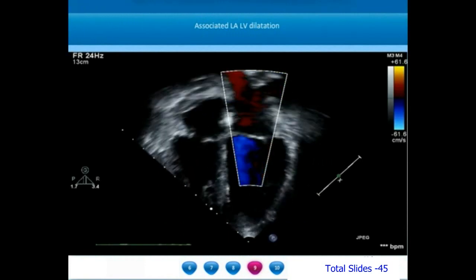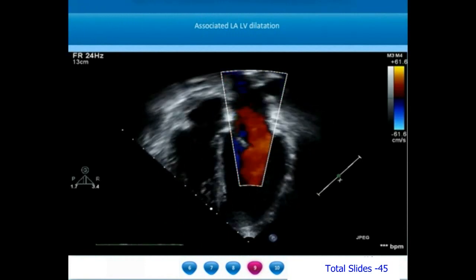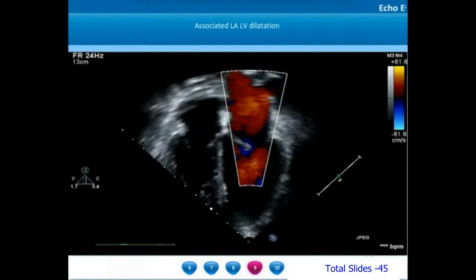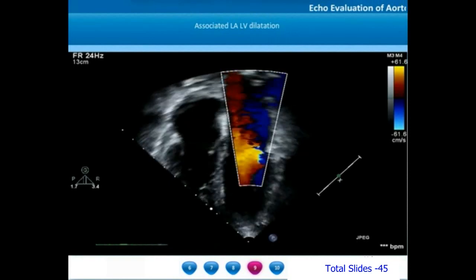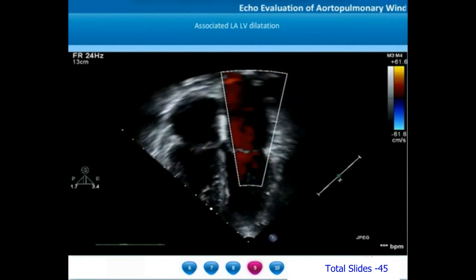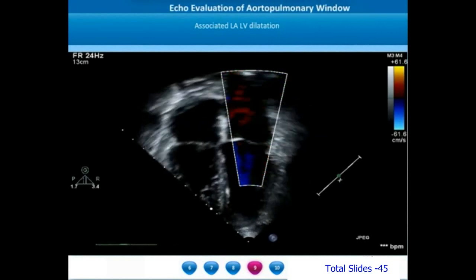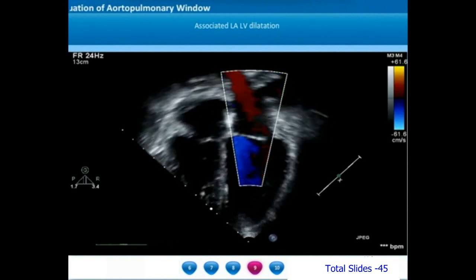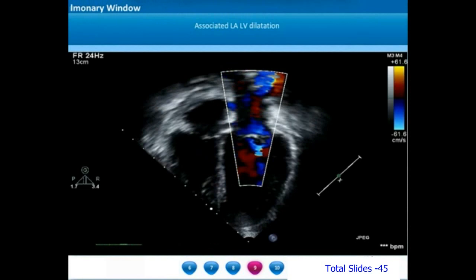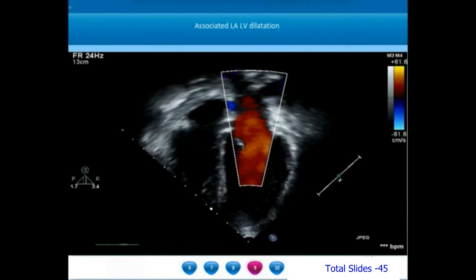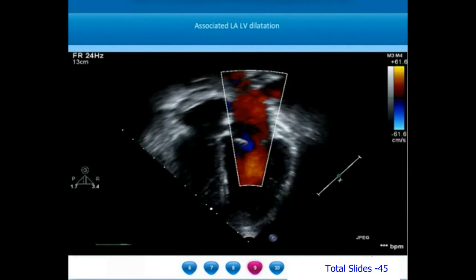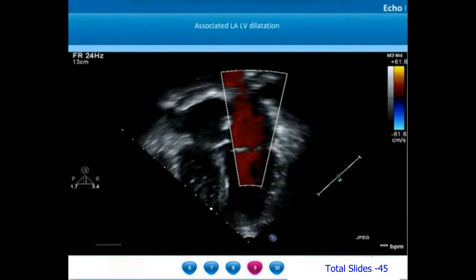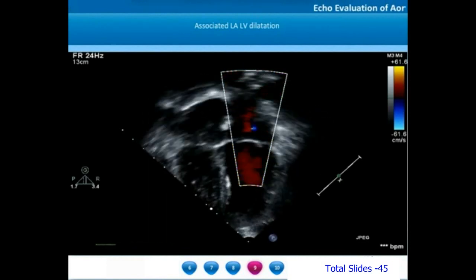Another way of identifying the presence of a large aortopulmonary window will be to look for an AP window whenever there is LA and LV dilatation. If there is a left atrial and left ventricular dilatation and you are not able to identify a ventricular septal defect or a patent ductus arteriosus, then aortopulmonary window is one of the causes for left-sided chamber dilatation.